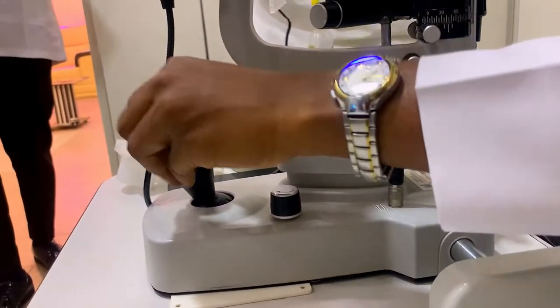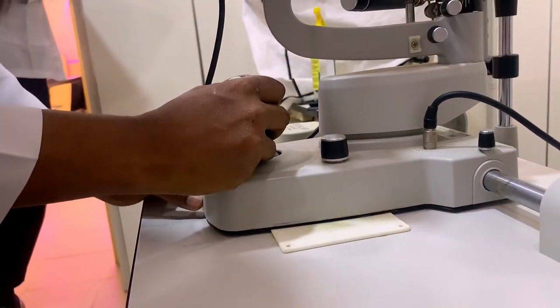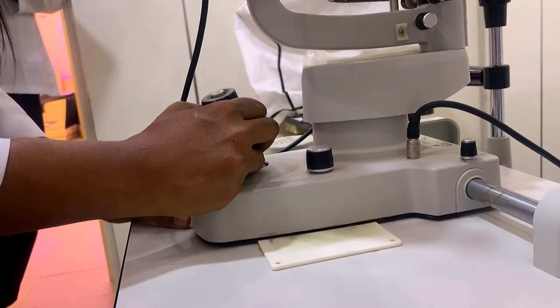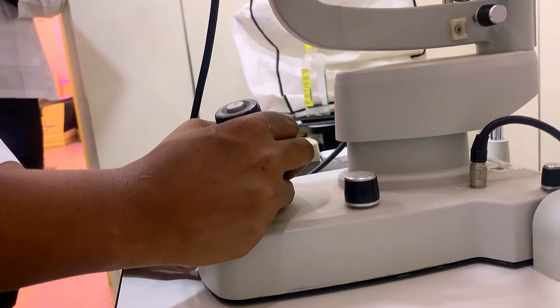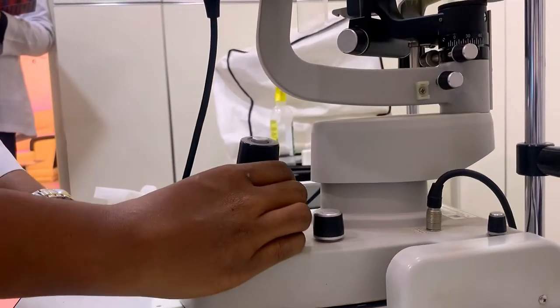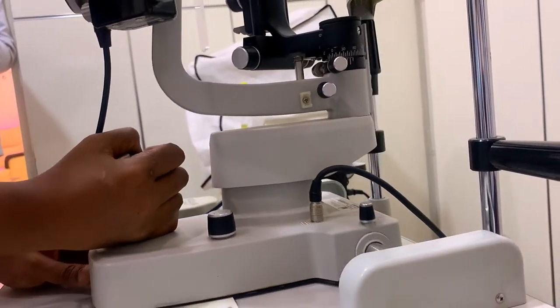Next is the joystick. This is what we call the joystick. The function of the joystick is that it helps you to have a horizontal movement of the slit lamp. Horizontally, that means you are moving the slit lamp to the patient's right eye or to the patient's left eye. If I want to move to the patient's left eye, I have to move the slit lamp to my right and then forward to the patient's eye. If I want to move it to the patient's right eye, I move it horizontally to the left and then forward.